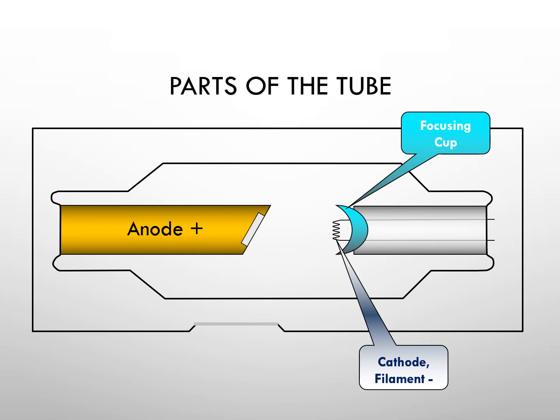To the left of the cathode is the anode. It has a positive charge, attracts the electrons, and conducts heat out of the X-ray tube. If the target were not there, the electron stream would melt a hole in the anode. The target can withstand the high heat of X-ray production and contains the focal spot.